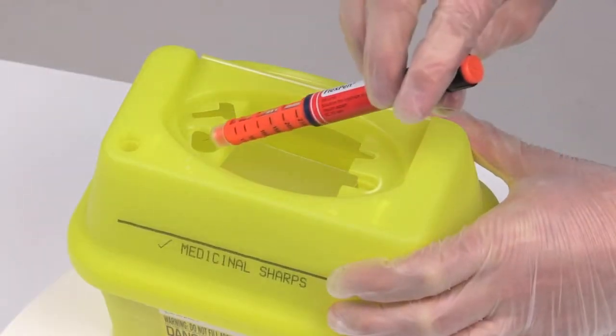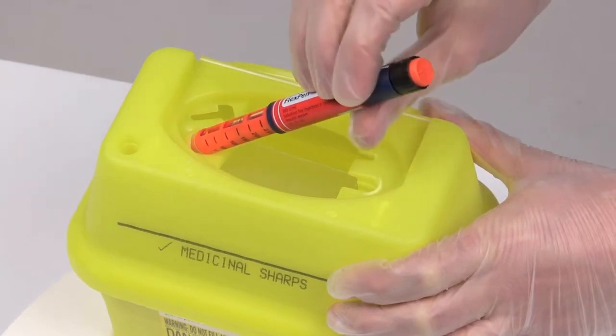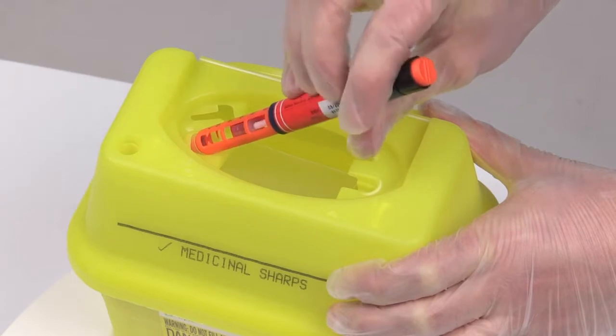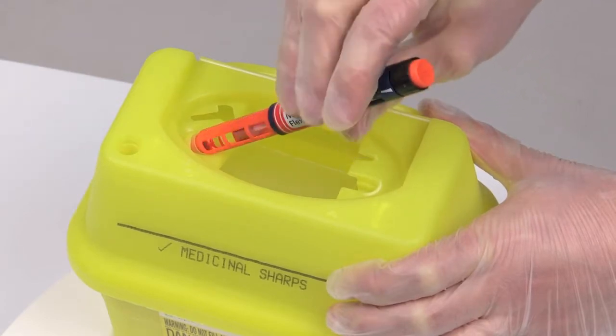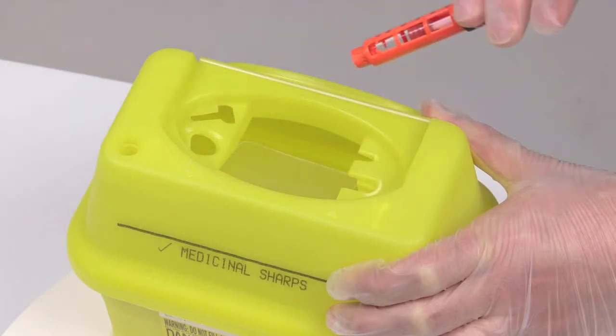Place the needle pen into the needle pen remover. Then, with the container held firmly, apply downward pressure to the needle pen and start to rotate anti-clockwise until the needle unscrews from the pen. Allow the needle to drop into the SharpSafe container.